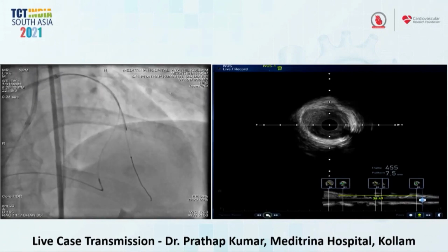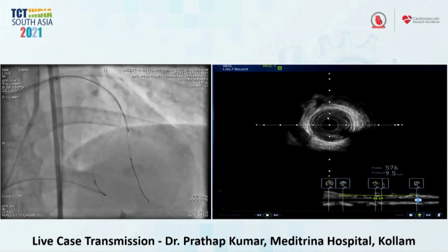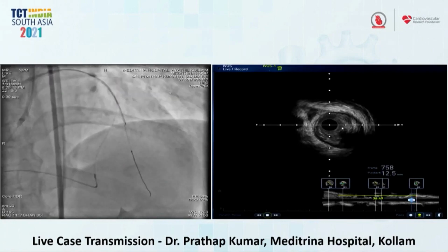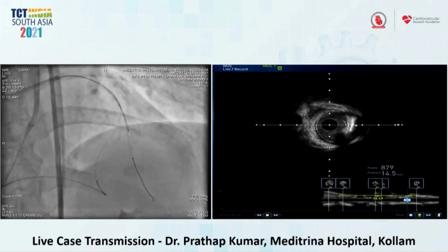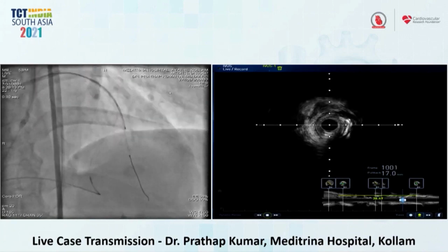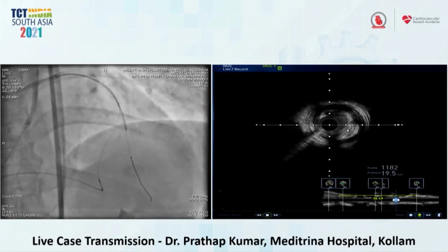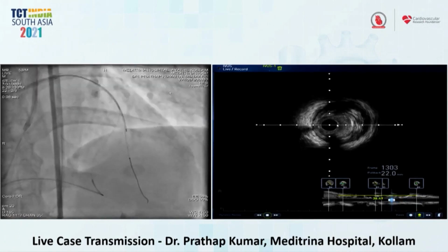Okay. Stalin, explain. We can see the distal LAD is almost like a 2.25 with very minimal plaque. Probably underfilled. Now we can see some significant disease over there. Fibrofatty, mixed plaque, some amount of calcium we can see at around 3 o'clock, 2 o'clock. Now again the calcium is increasing. You can see here it's almost 1 quadrant of calcium, 2 quadrants of calcium. And again back we have a significant disease over here.